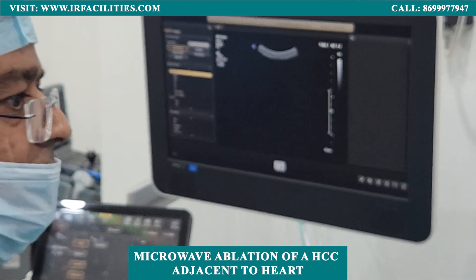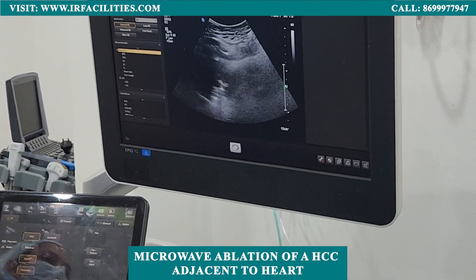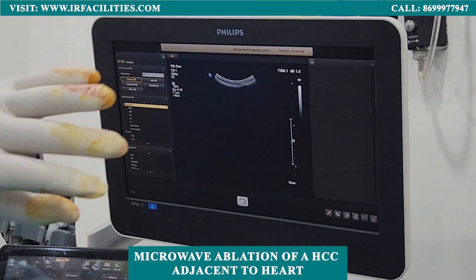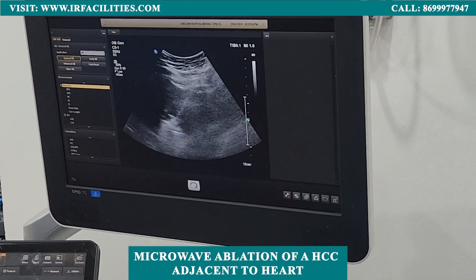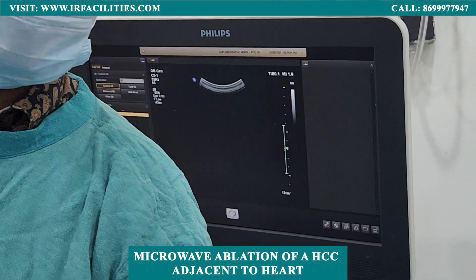Then we will see the fumes. Yes. Yes. So that's the additional fumes. Good work. And it is just one minute in process — one minute and thirty-seven seconds.